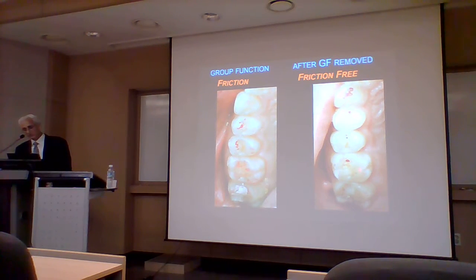And reduce those lines to point contact per tooth, except for the anterior guidance.